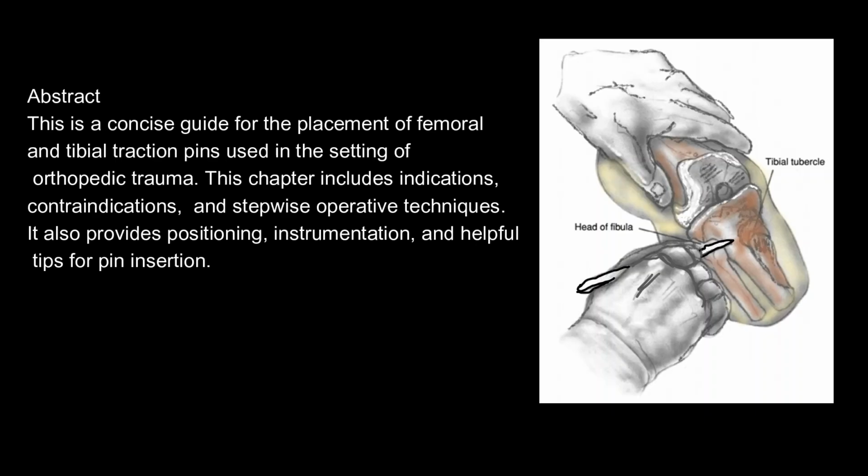Abstract: This is a concise guide for the placement of femoral and tibial traction pins used in the setting of orthopedic trauma. This chapter includes indications, contraindications, and stepwise operative techniques. It also provides positioning, instrumentation, and helpful tips for pin insertion.